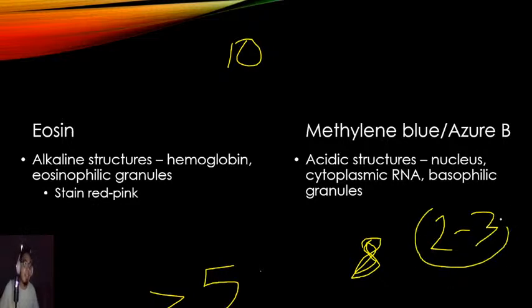All right? And in what Sir Marco told me, someone counted, how much was that, Sir Marco? 10 yata yun. 10 pataas. Yeah. So, guys, when you've counted more than 10 basophils, question yourself. Ask yourself this question: did I stain the sample correctly? That's the first thing that you're going to question. That's the first thing that you need to do.